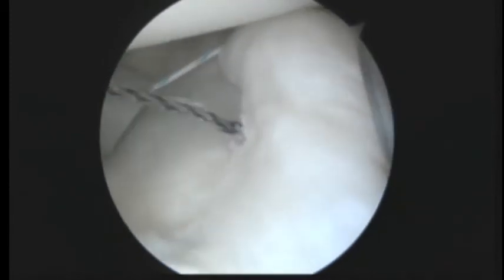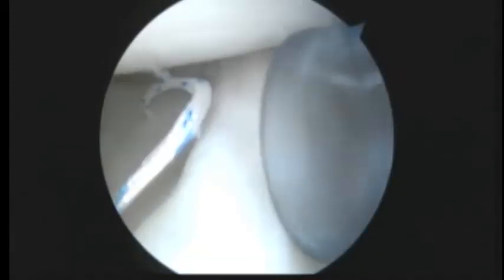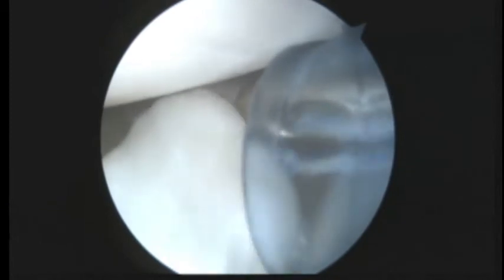Okay, so we'll retrieve that and load it and show you some more in a minute. Pause, please. Okay, so we've passed the second limb. You can see it coming across right there. And now we're going to get this stitch. And the next step is just like before. We're going to tie a knot. Pause, please. Okay, so we're just finishing up this knot here. There it is there.